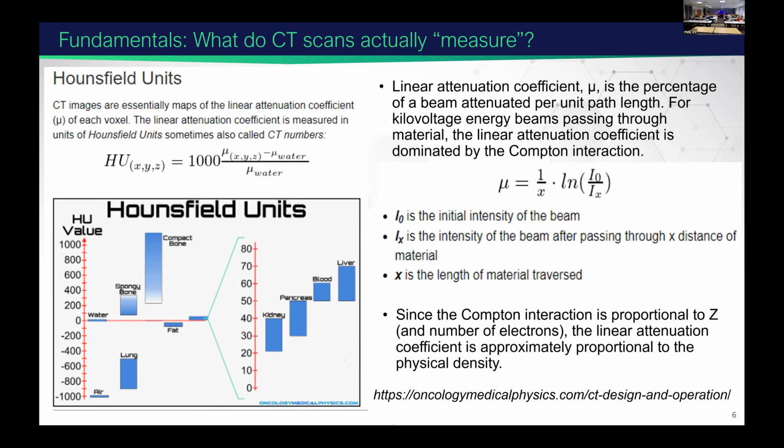And I want to mention Hounsfield units, which you see in the literature used by radiologists, often referred to as CT numbers. These Hounsfield units are basically a dimensionless, standardized number. It takes the radiodensity of water as 0, at standard temperature and pressure, and the radiodensity of air as -1000, also at STP, and basically sets a scale.